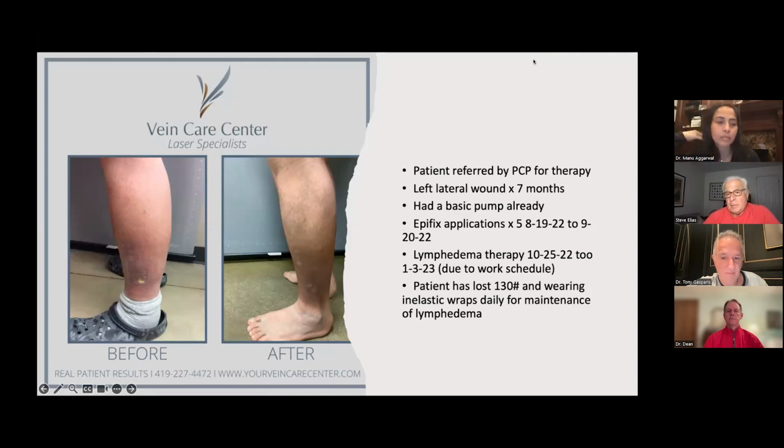So, we made the point before, it's usually like 4 to 6 weeks you tell them it's going to take to see something. And that's in general when you want to take a look at them again once you've instituted pump therapy. Would you kind of agree with that, to give people an idea as to when they would see those patients after they started pump therapy at home?